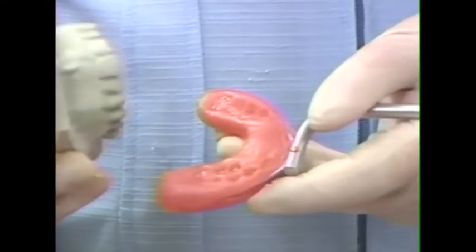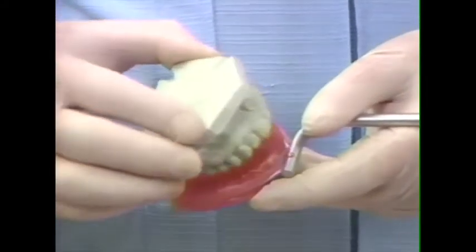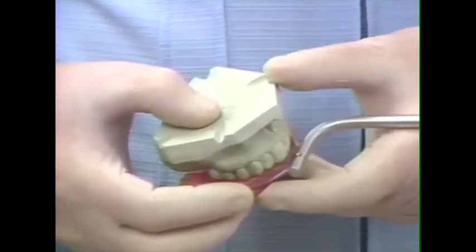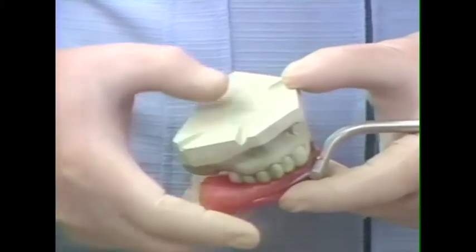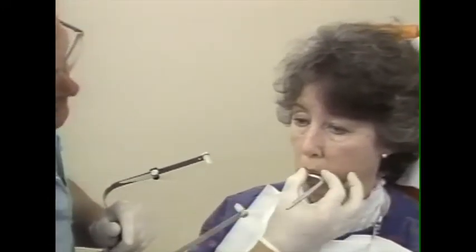It's very important that the cast or the occlusion rim be tested into the record after it's chilled to ensure that it is very stable. An unstable record will not have proper accuracy. Securing the face bow record is actually a very simple procedure. We first place the bite fork into the mouth. Be sure that it's in the proper indentations. And we've previously loosened all of the clamps.